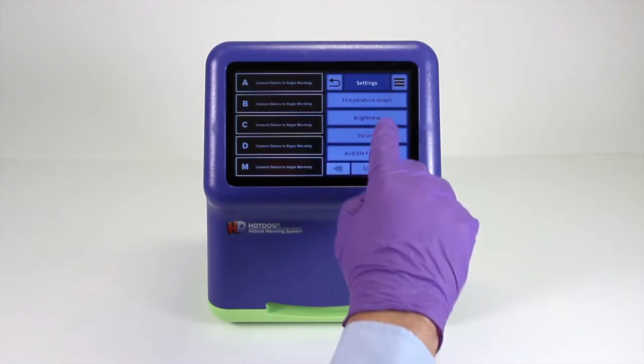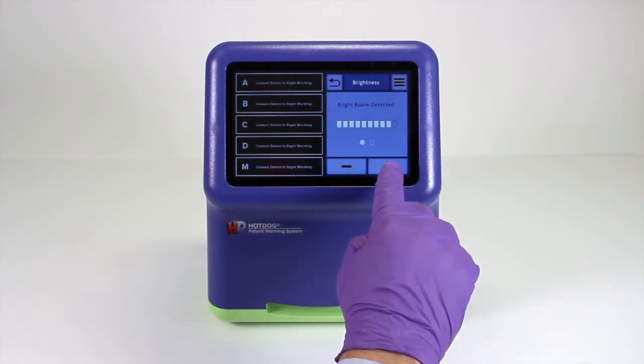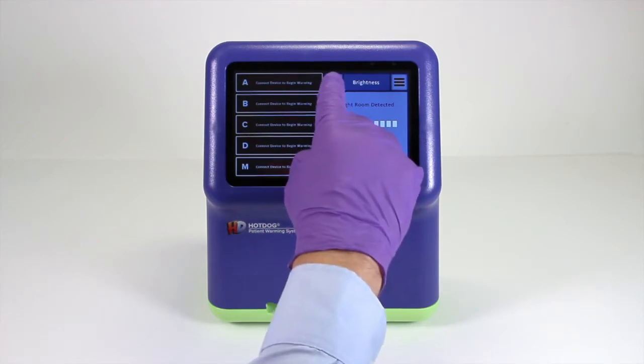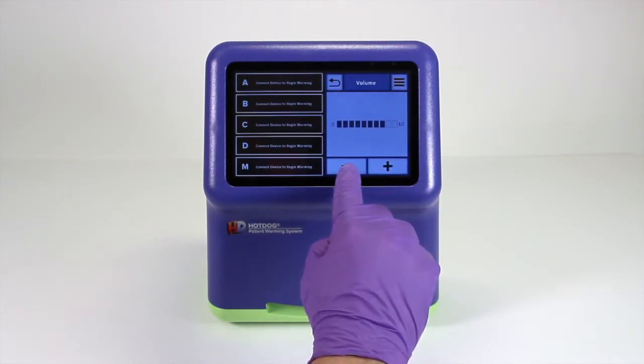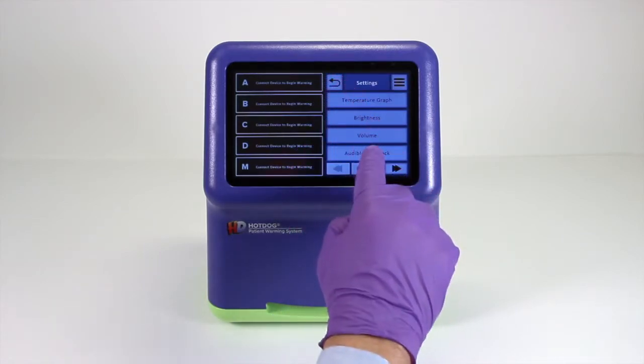Many touch screen settings are adjustable. The level of screen brightness can be set, and the controller also automatically detects if it is a dark room or a light room and adjusts accordingly. The volume can be set to a level of your choosing.